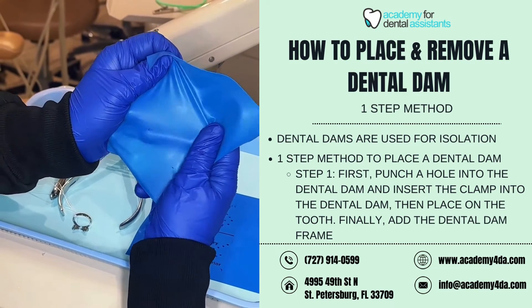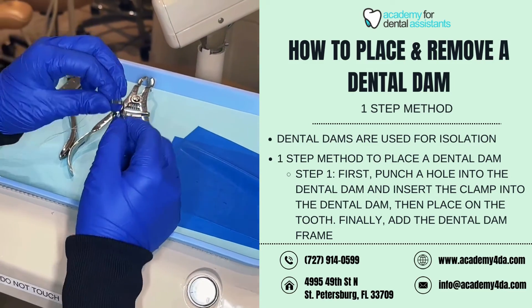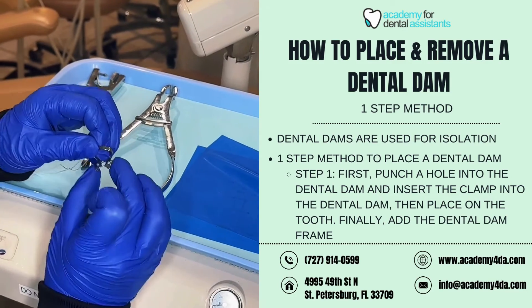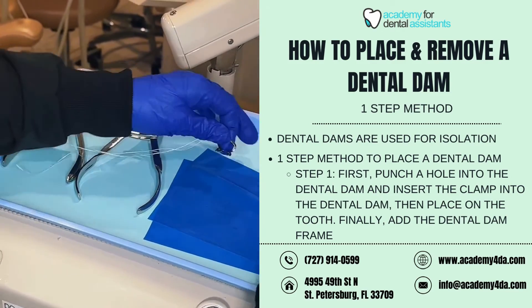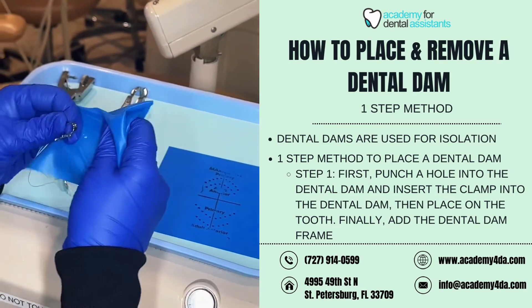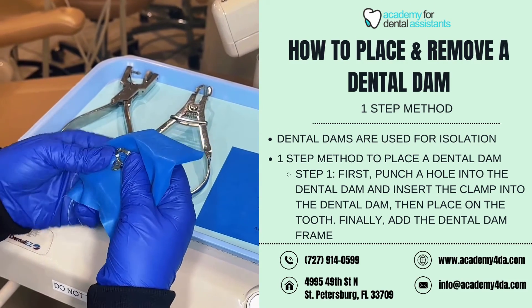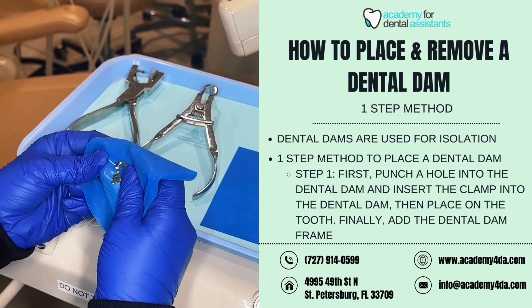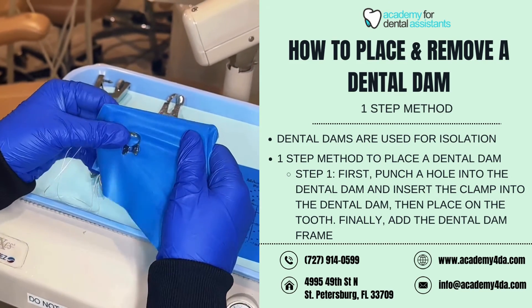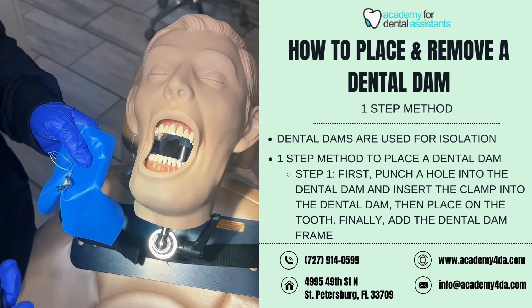Now that I have the hole punched in my dental dam, I'm going to grab my premolar clamp. I'm going to use the wings of this clamp — your clamp may not have wings, and that's fine. I'm going to place the wings inside of the hole I made on my dental dam, stretching it gently without ripping it around the wings.